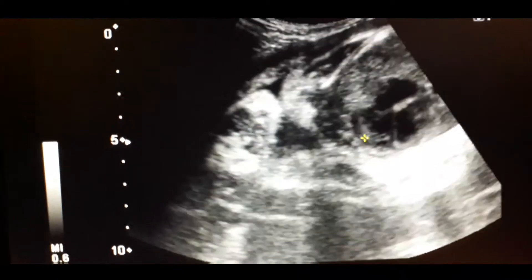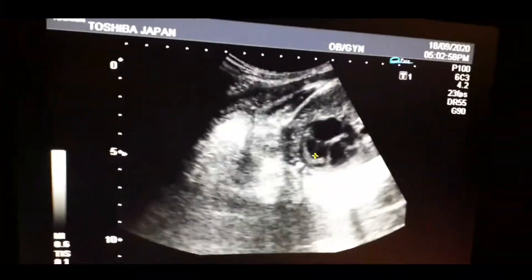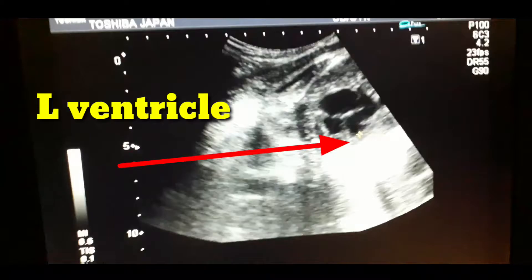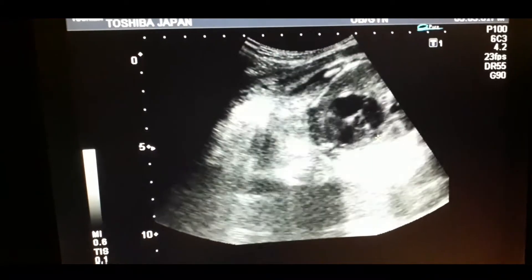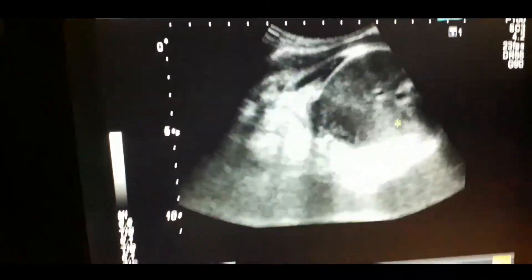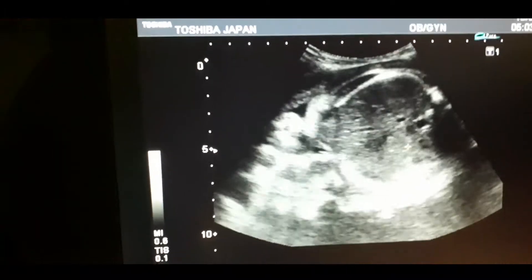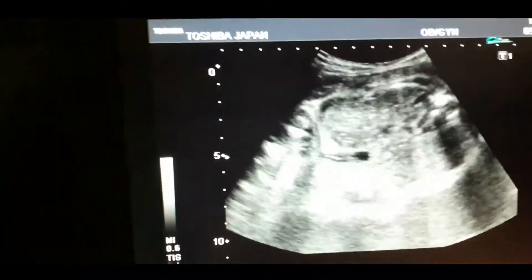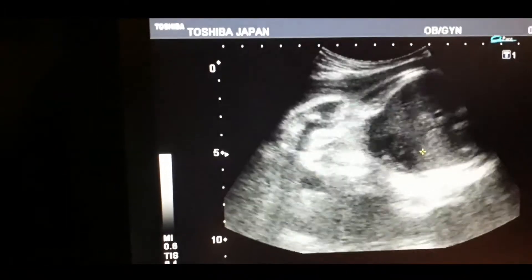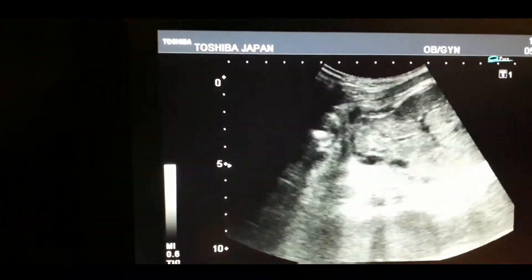This is the thick-walled right ventricle due to the moderated band. This is the left ventricle, this is the right ventricle, and you can also appreciate the relationship of the spine with the atria.